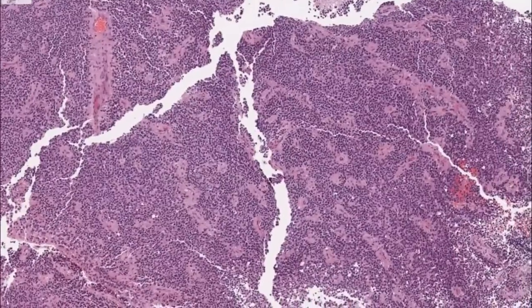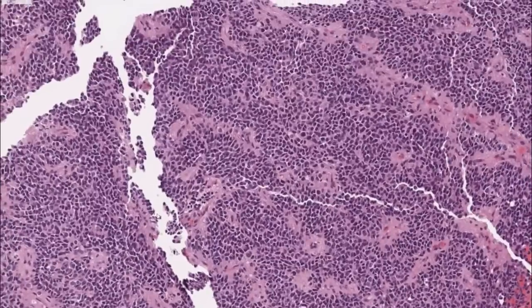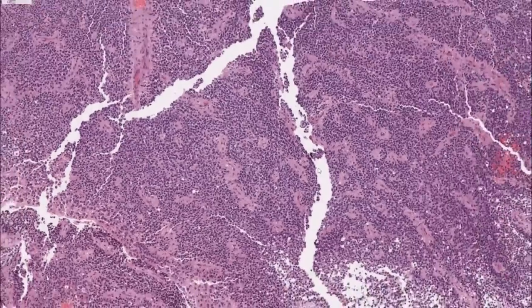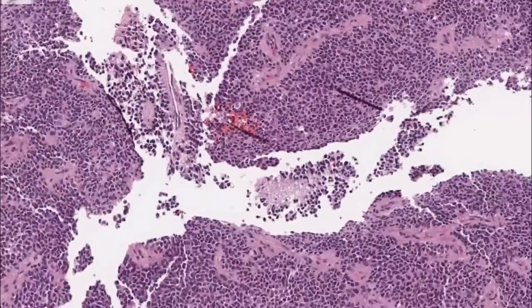So the differential diagnosis here is, the first differential diagnosis in a child is an embryonal tumor, some sort of embryonal tumor like medulloblastoma, particularly with that history of a posterior fossa mass, what used to be called PNET in the past, but we are not using that term anymore. So something embryonal or neuronal has to be entertained. And those tumors can also have pseudorosettes.